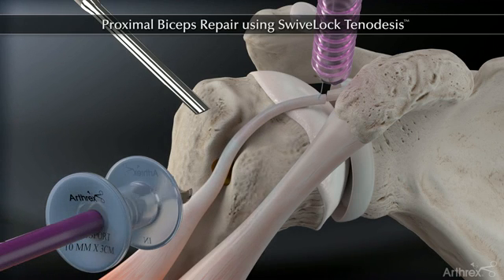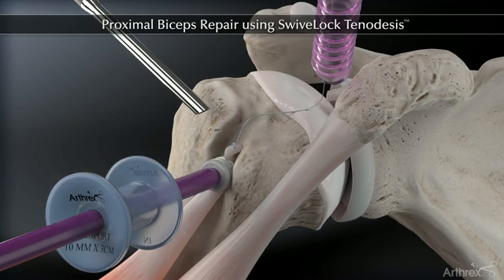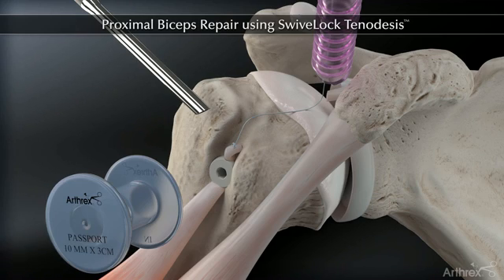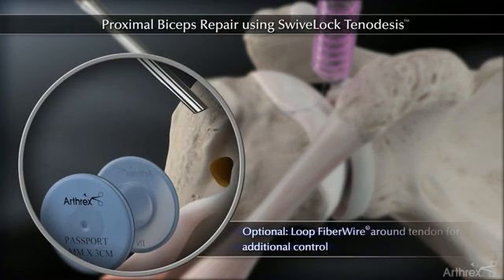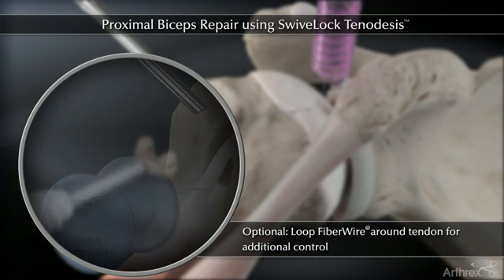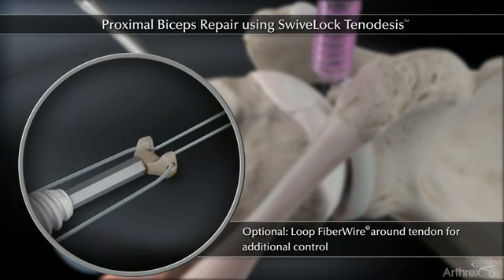Use the forked eyelet to steer the tendon into the bone socket and fixate with the screw. Leave the screw's rounded head slightly proud. If additional control of the tendon is desired, a fiber wire can be passed around the tendon and loaded through the holes in the forked tip.